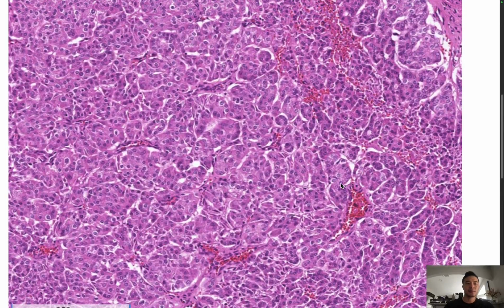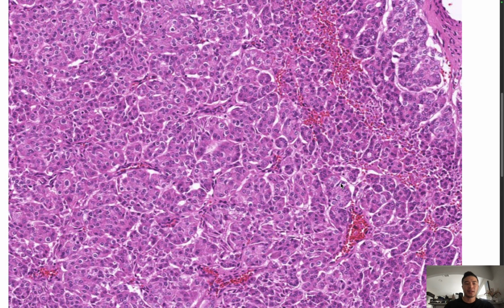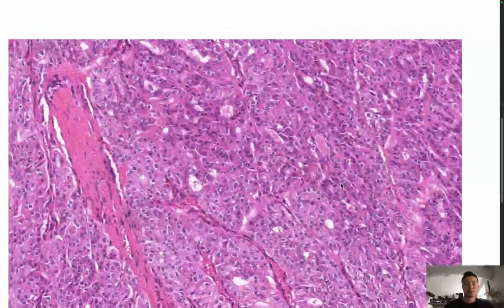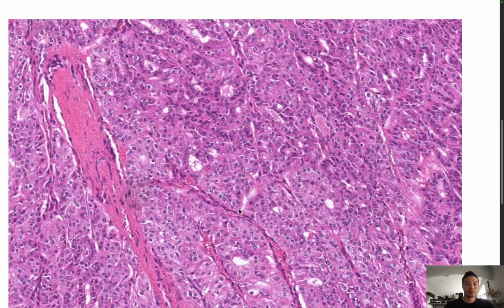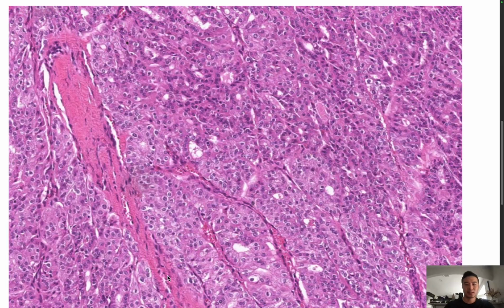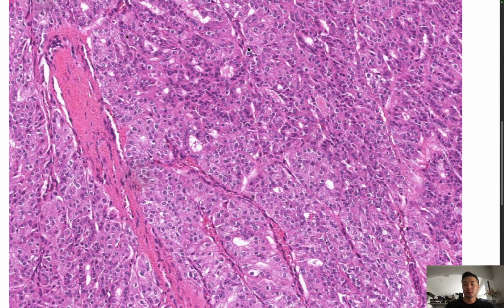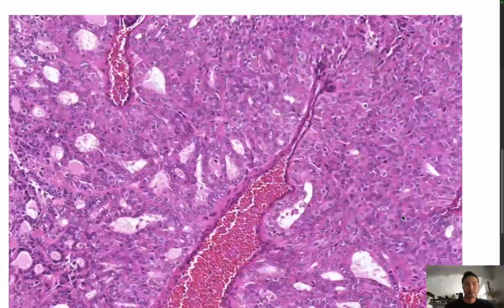There are no definitive intranuclear cytoplasmic inclusions that I can see, or INCIs, but the nuclear atypia is present due to the nuclei being larger than the red blood cells, and some pinpoint eccentric nucleoli that are present in not just one or two, but predominantly most of them. And then we see those branch-like vessels transgressing into the tumor.